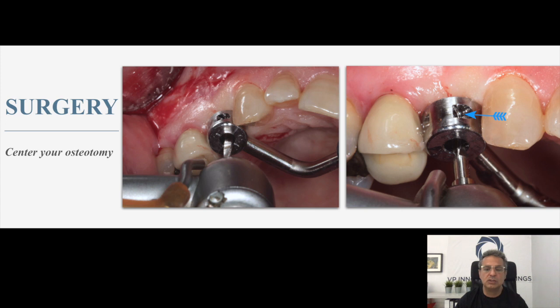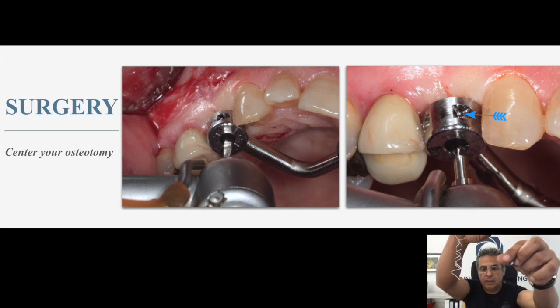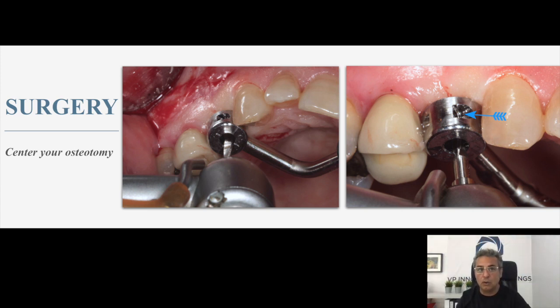he begins his osteotomy. On the tab itself, where the arrow is, there is also a borehole in that area there, and the reason for that is exactly this. If you feel a little bit uncomfortable, you're able to pass some floss through there and just get your assistant to hold on to it, just in case you feel a little bit on edge and you're not sure and you don't want anybody ingesting a tab.